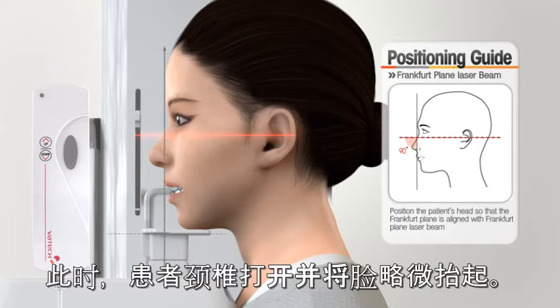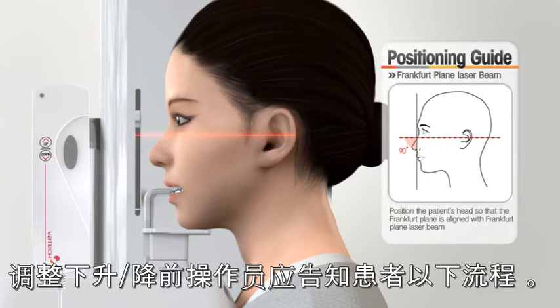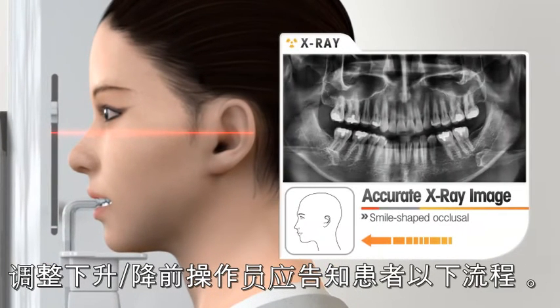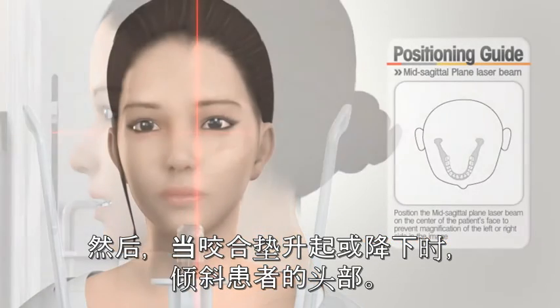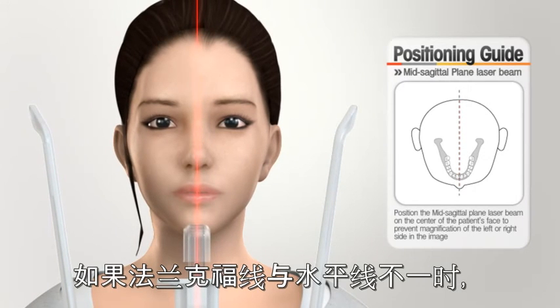Before pressing the up-down switch, the operator should inform the patient of the following process. First, keep the shoulder and neck level. Second, tilt the patient's head when the chin support goes up or down. If the Frankfurt plane beam is not parallel to the Frankfurt plane, the occlusal plane on the image will be flat or V-shaped. Make sure that the mid-sagittal plane laser beam is positioned at the center of the patient's face.